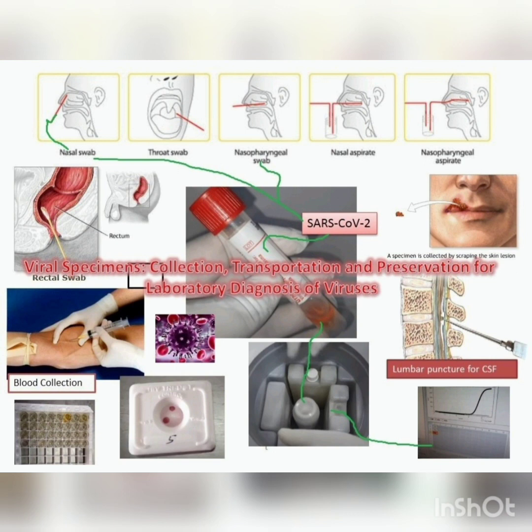Next, let us discuss the specimen containers and their transport. The container where you keep the specimen, a test tube or some bottle, is known as a container.